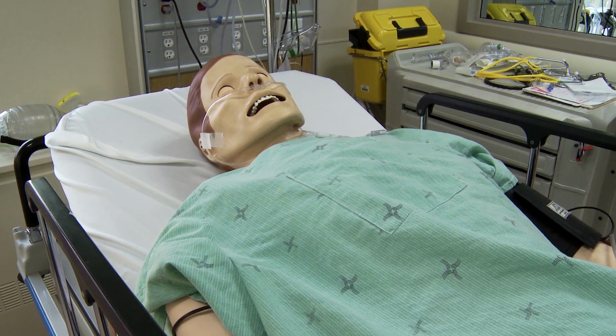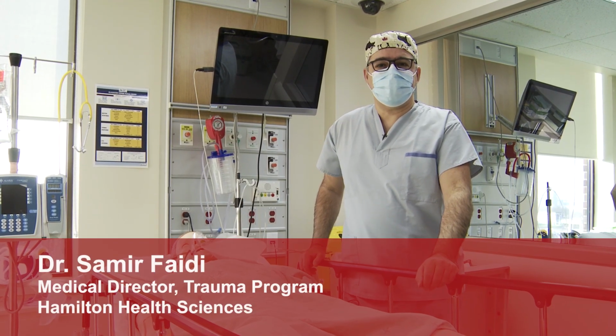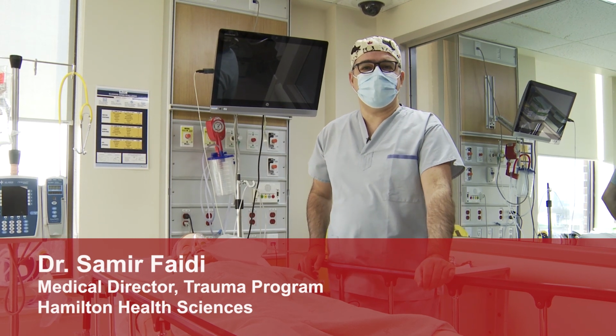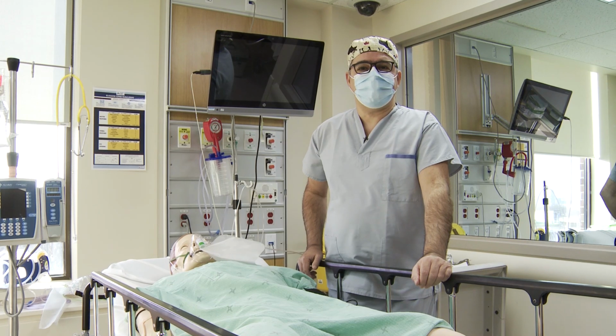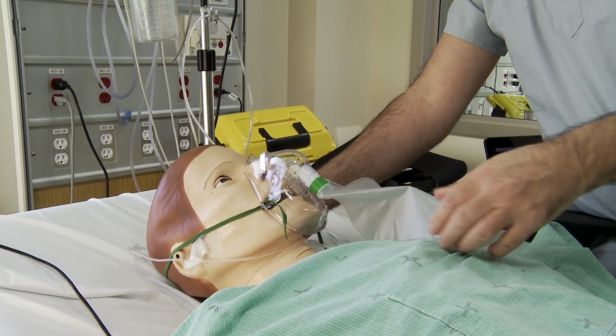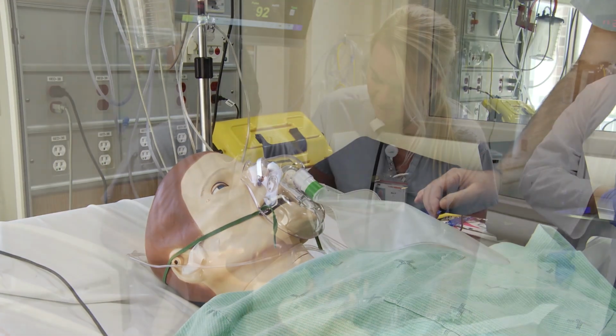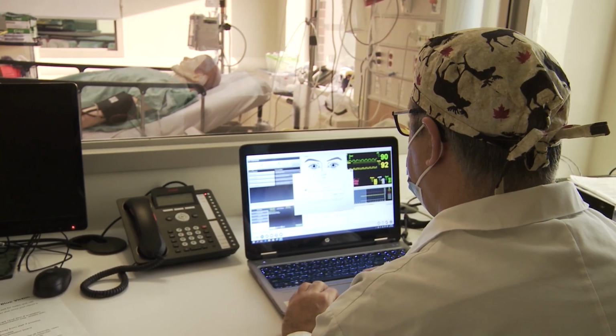We are in the simulation room, one of the teaching rooms at the Hamilton General Hospital, and a trauma program and intensive care unit program too. It's one of the tools that we use for education. This room is being used for learners running trauma case scenarios or other acute medical emergency scenarios. So we try to replicate what's happening in real life.